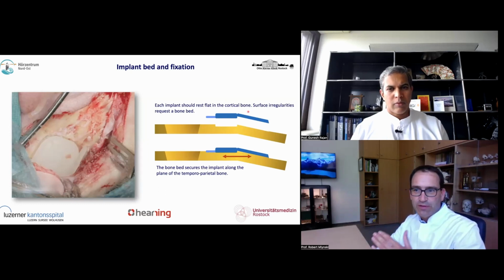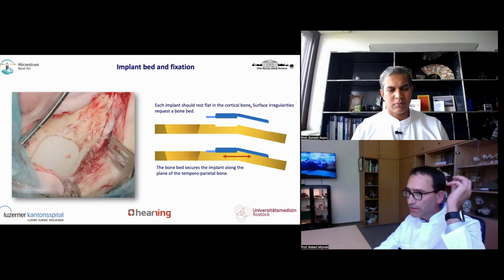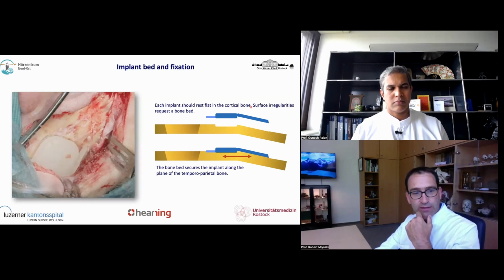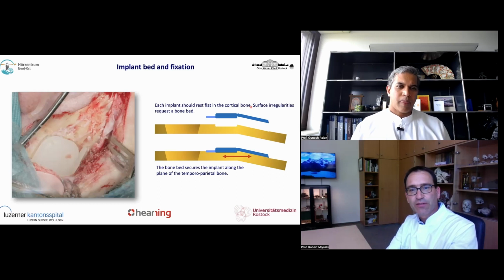You always have to think of that. The temporal muscle, every time you chew, gives a force on the implant. Then the coil being placed gives also stress to the implant, and the patient shouldn't have it every day somewhere else. First thing, and second thing, if it moves, at the place where it moves you have seroma or hematoma, and this can cause infection. So I think the implant should be very well fixed.